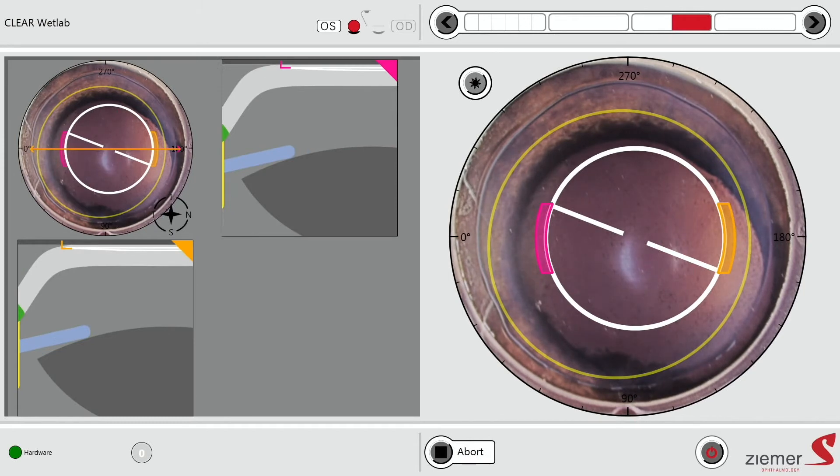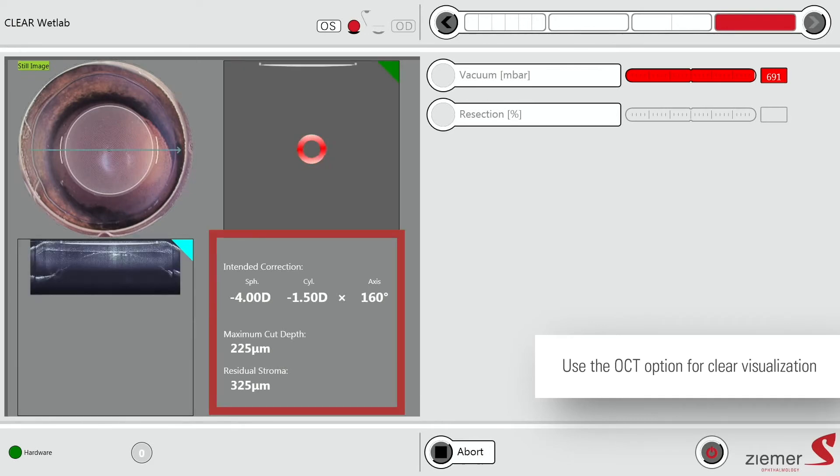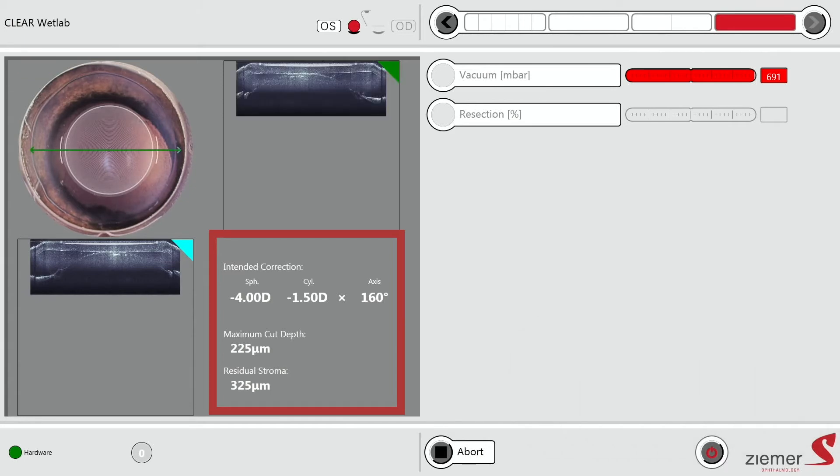You can also check the incision. There is an optional OCT that you can have. If you would like, you can make an OCT picture of your eye. And then here before starting, you have always again a summary of the correction you want to apply on this eye. And then I can proceed with the treatment.